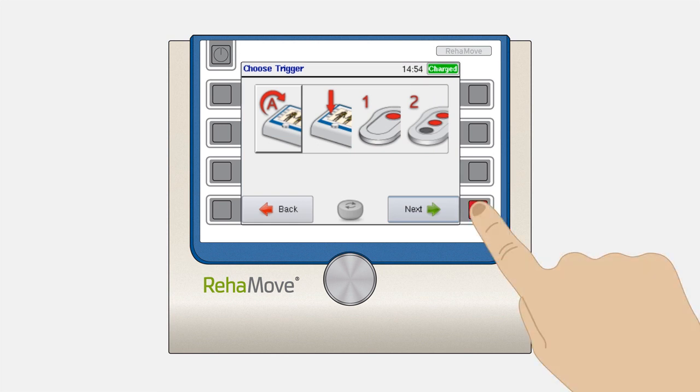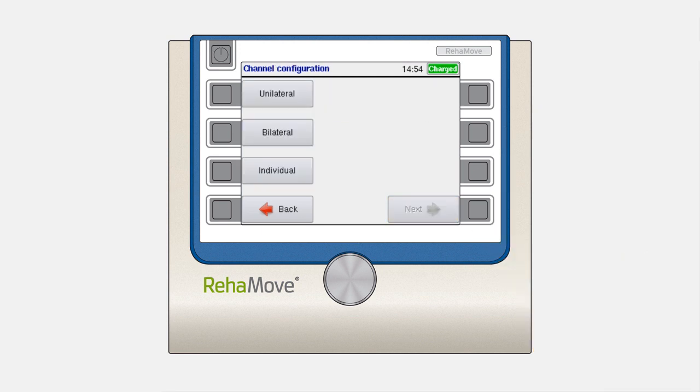Now press the next button to go to the channel configuration. Here you can choose between three options, namely unilateral, bilateral or individual.